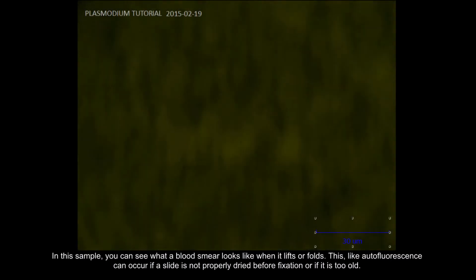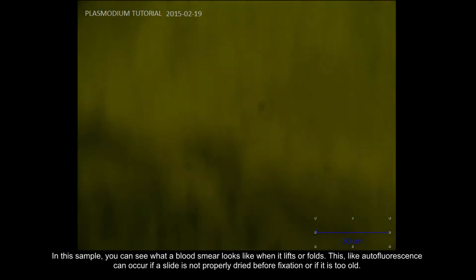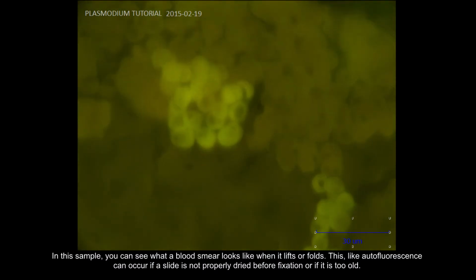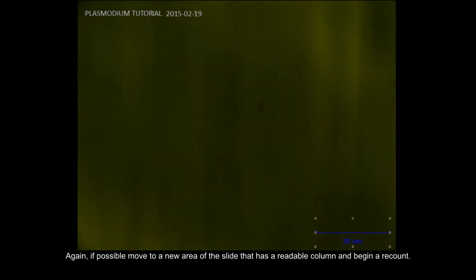In this sample, you can see what a blood smear looks like when it lifts or folds. This, like autofluorescence, can occur if a slide is not properly dried before fixation or if it is too old. Again, if possible, move to a new area of the slide that has a readable column and begin a recount.